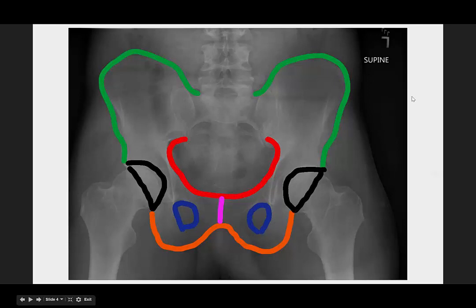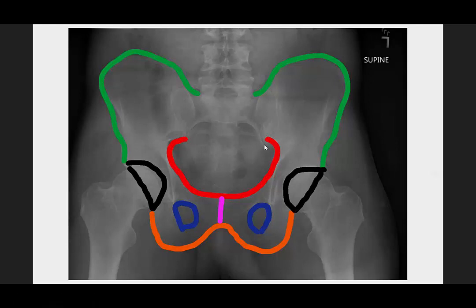I like to start from the top and work my way down. I follow the iliac wings first on both sides, and I stop right when I get to the acetabulum, checking both sides for any cortical irregularities that may indicate a fracture. Take a look at the pelvic ring. There is a fracture that can go across the sacrum, so you have to look at this area to see if there's any irregularity in the line-up between the ilium and the sacrum.